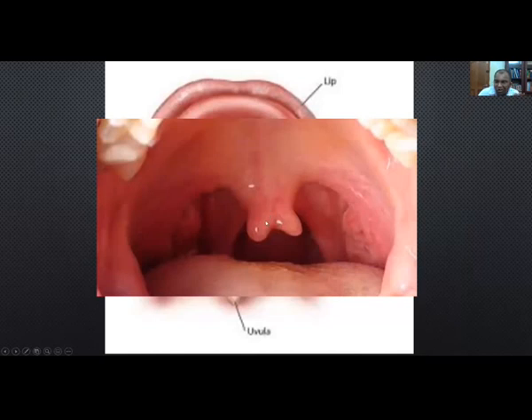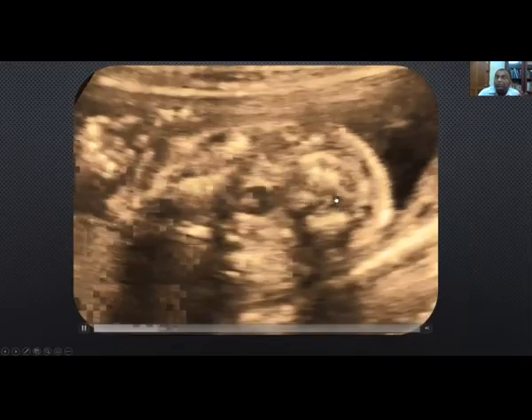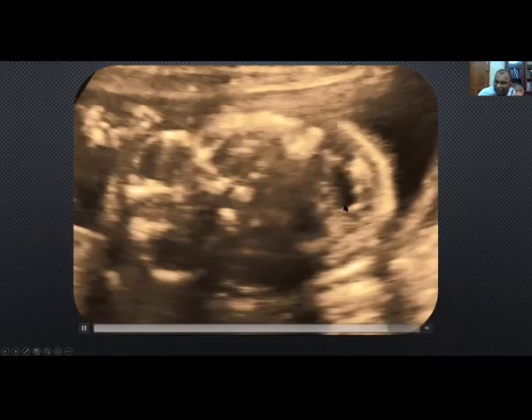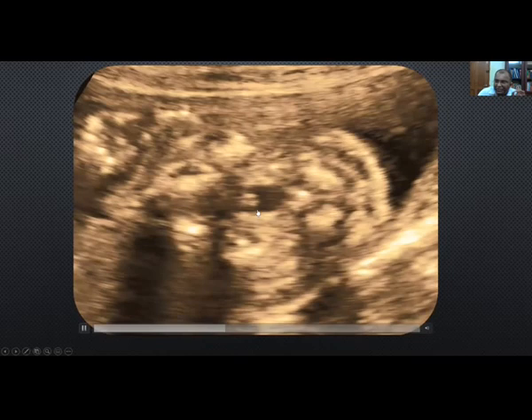The mildest form of soft palate cleft, I'm talking about isolated soft palate cleft, is a bifid uvula. So if you can see an intact uvula, it rules out a soft palate cleft. I'm talking now about secondary palate cleft, or posterior palate cleft, including the soft palate.